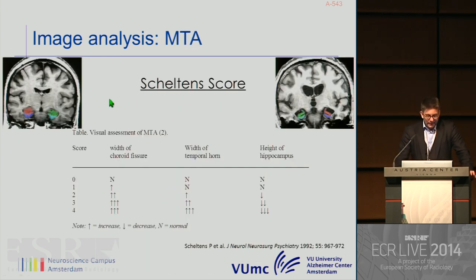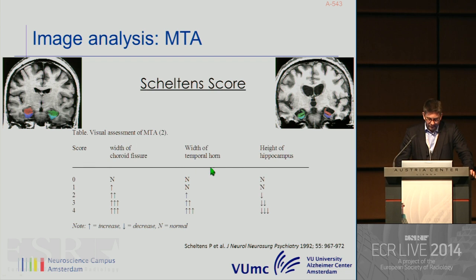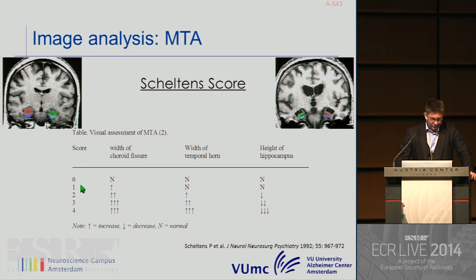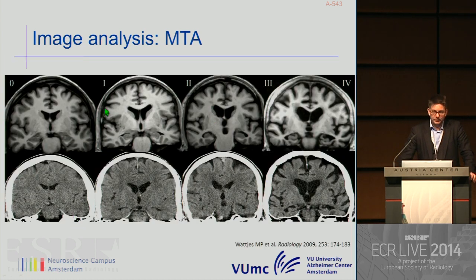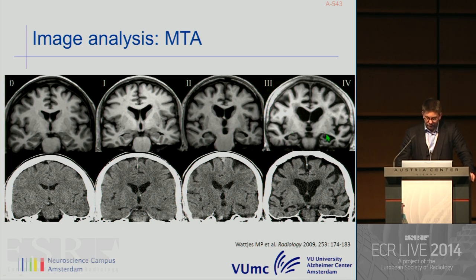Moving to the MTA: the hippocampus is very crucial in terms of memory decline. We use the so-called Scheltens scale, dealing with three relevant anatomic landmarks: the width of the choroid fissure, the width of the temporal horn, and the volume of the hippocampus. We deal with a score from 0 to end-stage atrophy score 4. Grade 0 is normal; grade 1 shows slightly widened choroid fissure; grade 2, already a slight volume loss of the hippocampus; and grades 3 and 4, the volume loss becomes more pronounced.